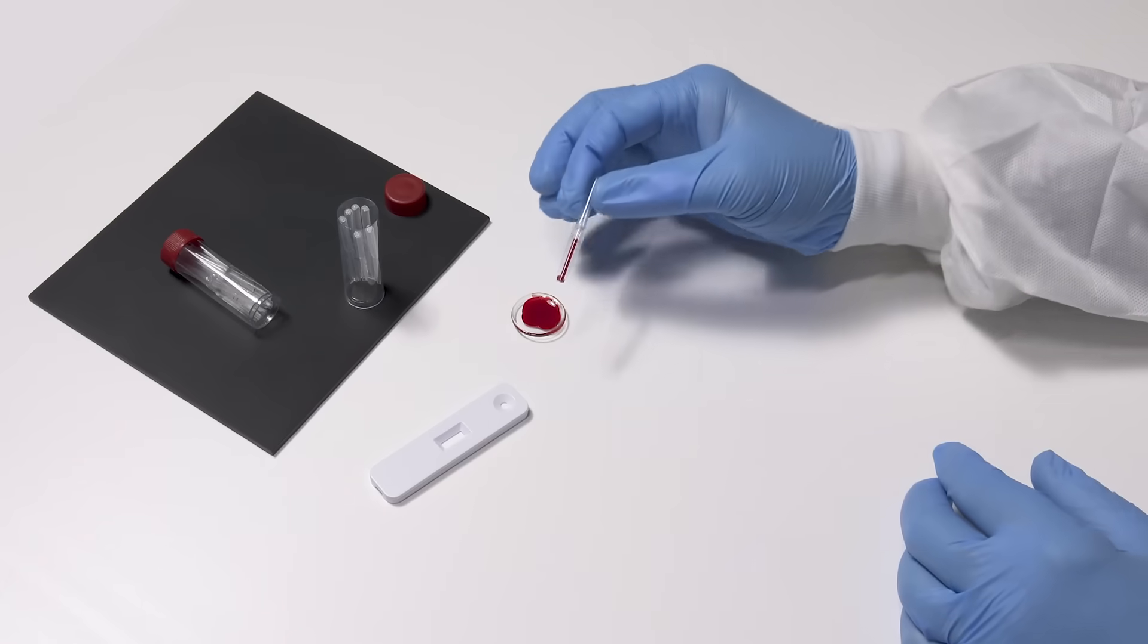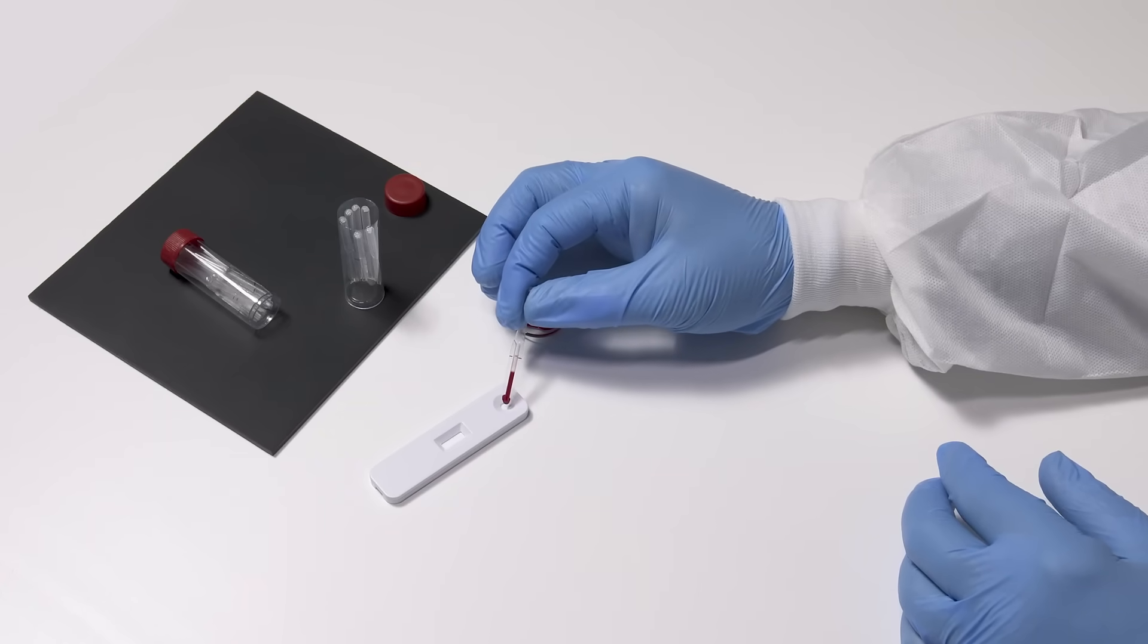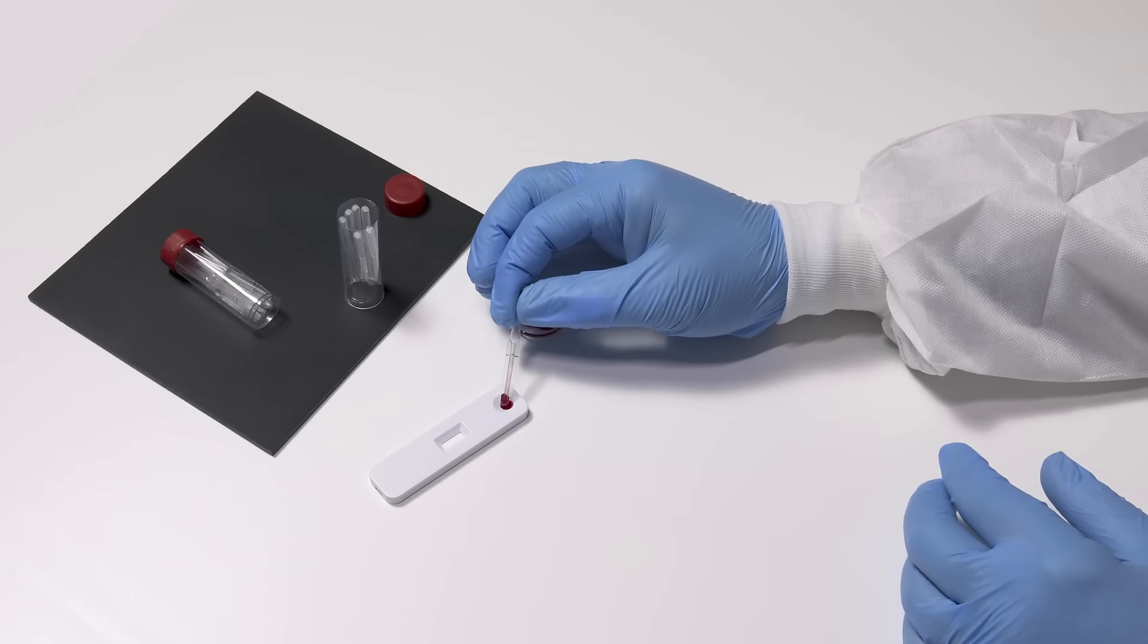Once filled, the blood is dispensed by squeezing the bulb with continuous pressure until the entire sample is delivered to the sample target area. The delivered sample has a volumetric tolerance of 0 to 10%.